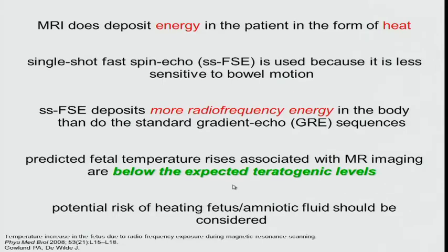So MR does deposit energy into the patient in the form of heat. And one of the sequences that we're going to use is called, and I just want to tell the first years, this is going to sound like Martian for about a year and a half, all these different sequences. But the more times that you hear it, it will start to make some sense. Another thing that you can do to help yourself is you can go online and look up these sequences. They'll usually have a list of sequences, and they'll show you which sequence acronyms go with which vendor.